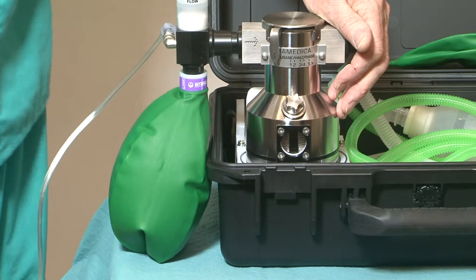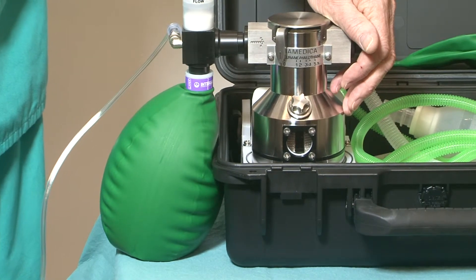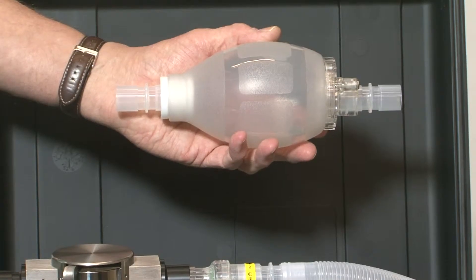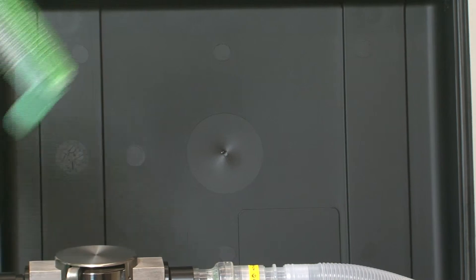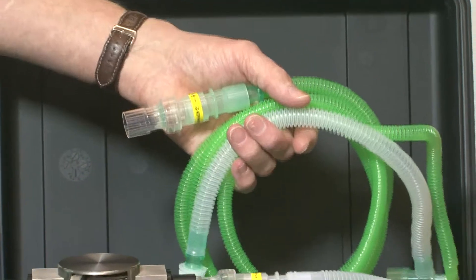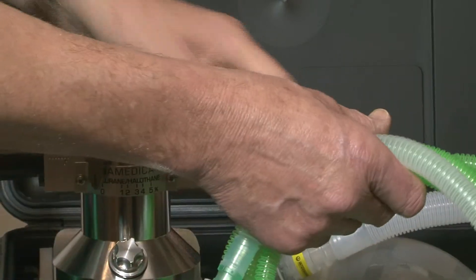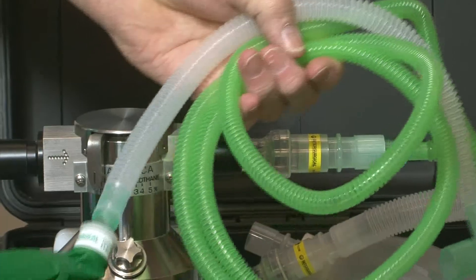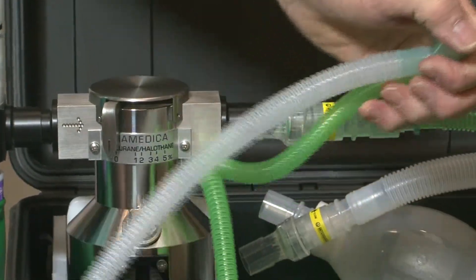The vaporizer will function in either drawover or continuous flow. A smaller self-inflating bag is provided for pediatric use and an Ayre's T-piece can also be fitted if required. In order to use the T-piece, the supplementary oxygen must be at least three times the patient's minute volume.